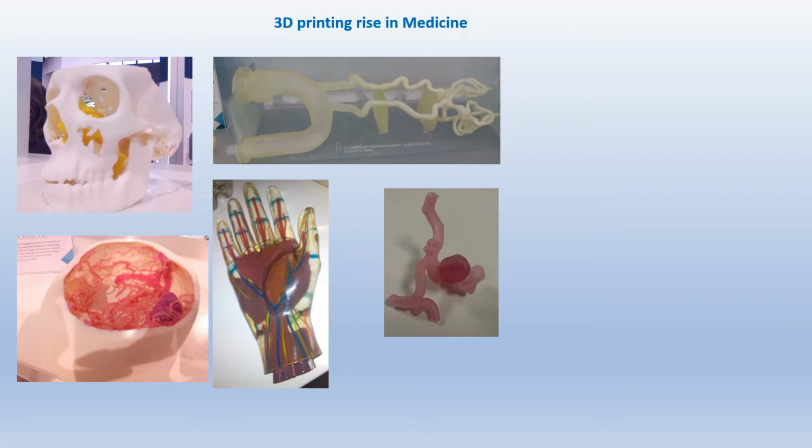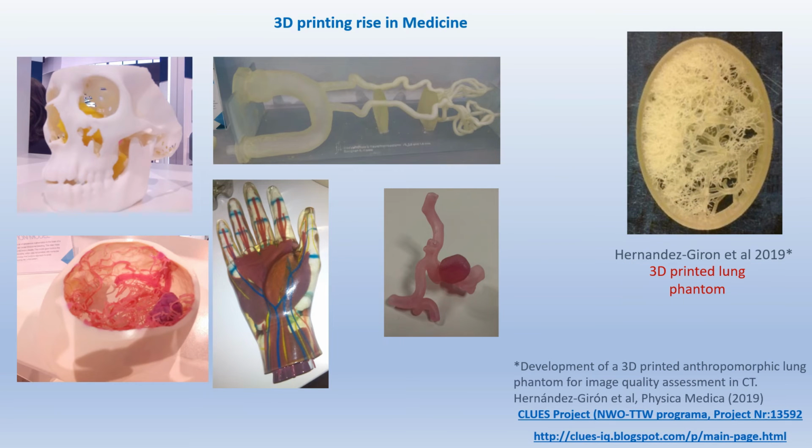The use of 3D printing in different applications in medicine is on the rise. There is a need for realistic anthropomorphic phantoms that mimic the X-ray attenuation of patient tissues and their anatomy and morphometry. 3D printing is being used at research level to manufacture customized texture anthropomorphic phantoms for image quality assessment. The evaluation of accuracy and reproducibility of 3D printing techniques for phantom creation is still under development, and this in part motivated this work.